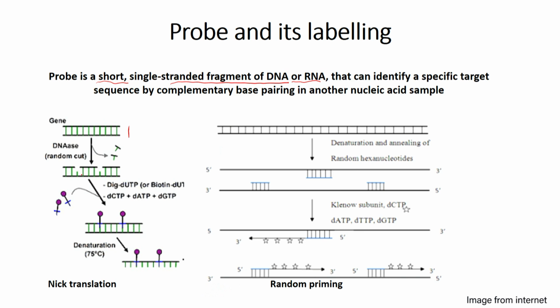So, this is the nick translation, that there are nicks and here you are using dig-dUTP. This is a labeled deoxy-UTP and this dig means this has a label with it.